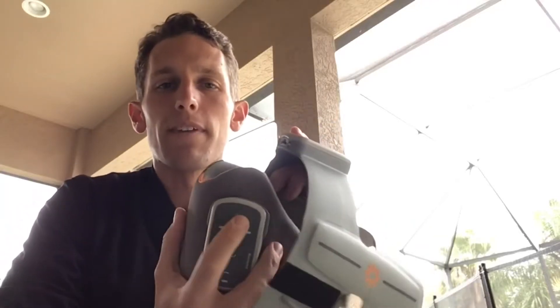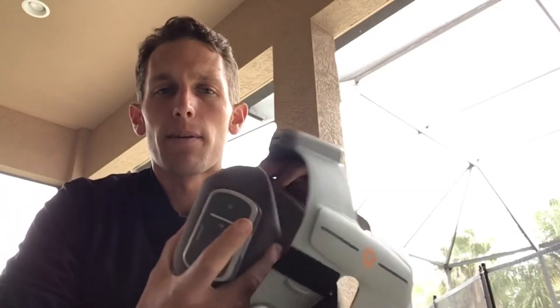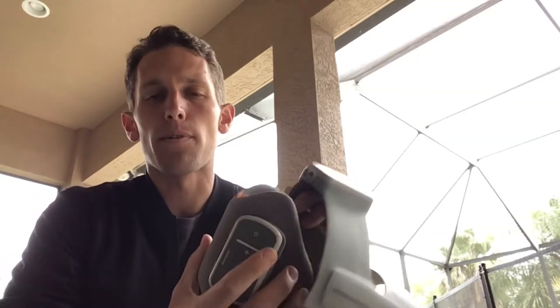I want to quickly make a video as a reminder about pairing both the lower and the upper cuff to our programmer. Sometimes folks get confused with this about the actual pairing process once you have them both connected to each other.